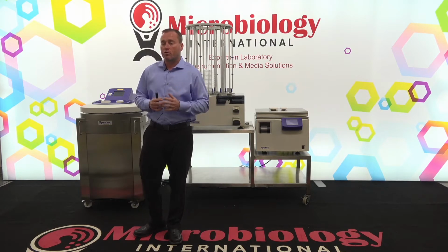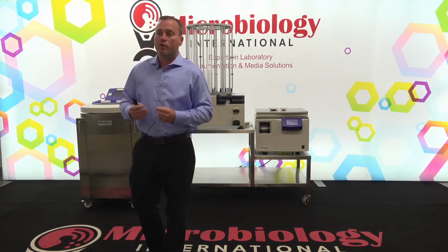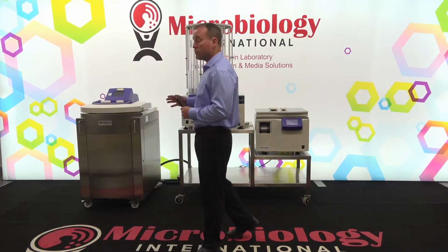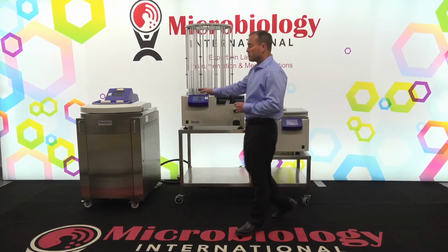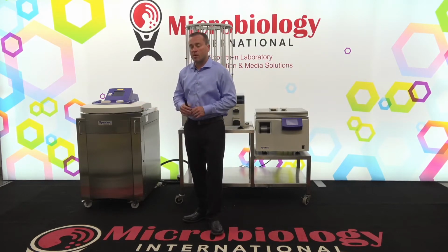We're going to go through a demonstration of our media preparation equipment, and we will do a brief PowerPoint presentation, then go back in and do a practical demonstration of the units that I have with me here today. We have our MediaPrep 10, the MediaFill 440, and also a MediaPrep 120, just to give an idea of the range of sizes that we have.